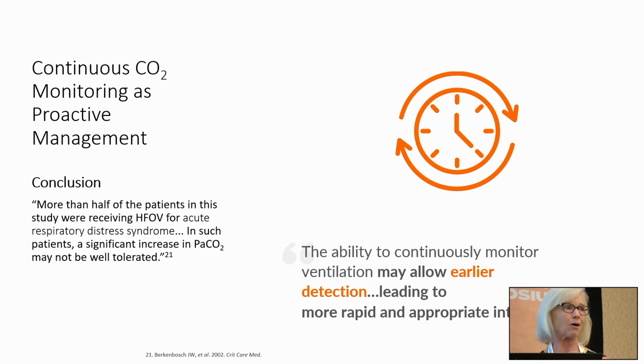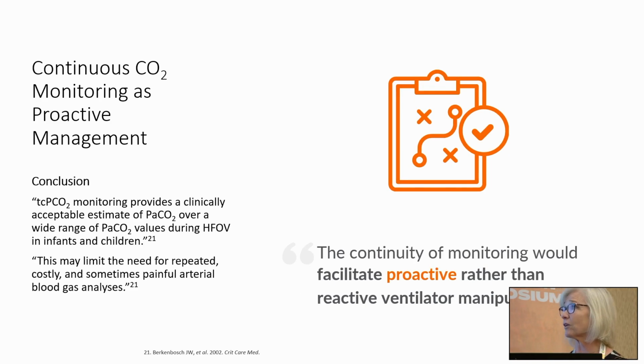Places aren't replacing their blood gases with this, but they're getting clearer visibility to the full status. So a lot of times they are decreasing the number of blood gases, which is the goal. Some places do trust it to where they're doing blood gases every other day. But this team did find that it was very helpful, and they were able to, again, treat those patients proactively versus reactively.